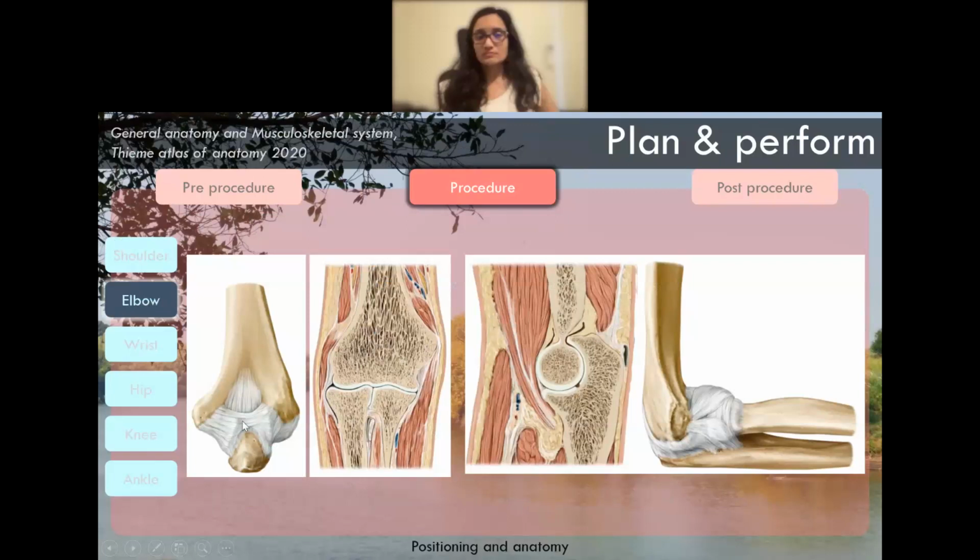Now moving on to the elbow joint, regarding the anatomical features of the elbow joint, this is the posterior and lateral view. This is the capsule that is securing the elbow joint. What we can see here is, medially, we have the ulnar neurovascular bundle, anteriorly we have the brachial vessels and the median nerve, and the anterior recess of the elbow joint is very small, seen below the brachialis here. We have two areas to access the elbow joint. One is the posterolateral recess approach, another one is the lateral approach.